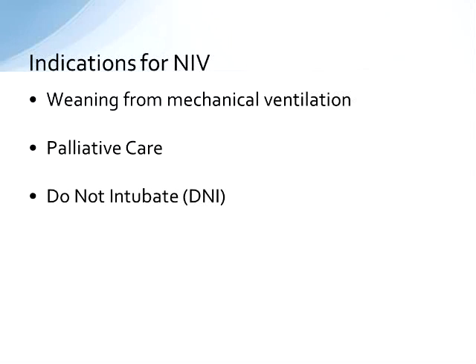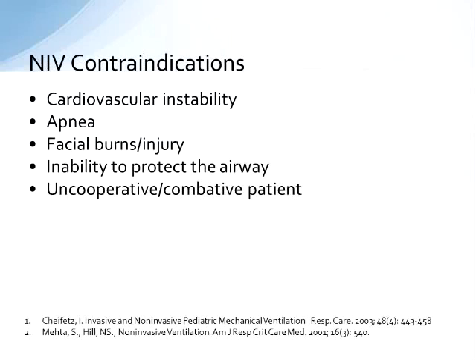And we have used it for children on palliative care to help facilitate getting them out of our ICU and getting them home to be with their parents. I think this is pretty significant for families who are going through particular terminal illness to be able to have that child at home with them rather than to spend the entire lifespan of their child in the ICU. So I'm seeing that used more and more commonly for those patients on palliative care.